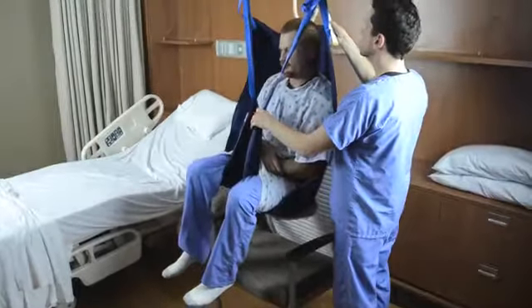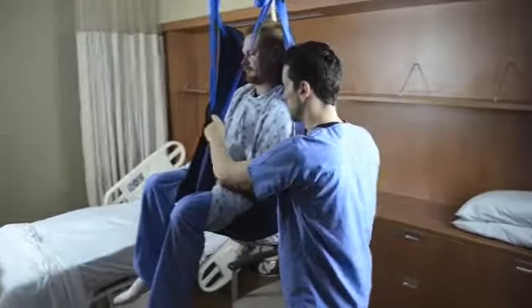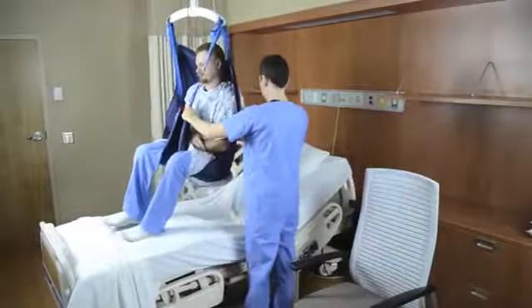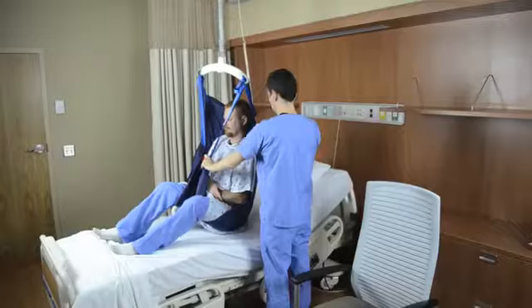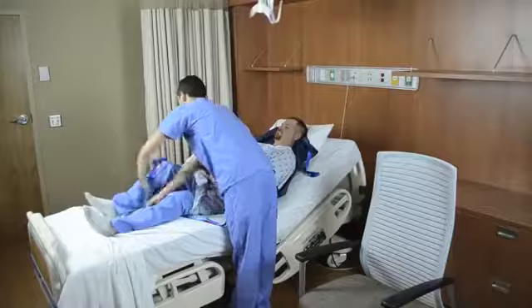Raise the patient four to six inches off the chair. Check to ensure the patient is secure and comfortable. Continue to raise the patient until he is high enough to clear the chair and bed. Guide the patient to the bed. Make sure the patient is at the head of the bed and centered before lowering.